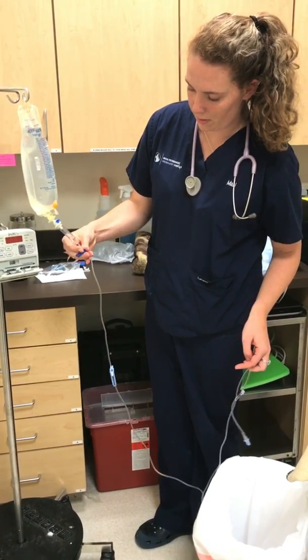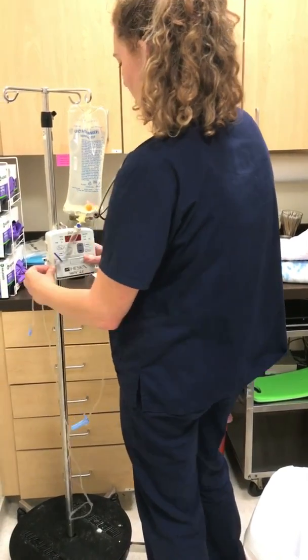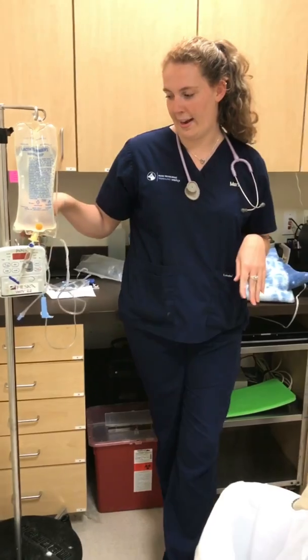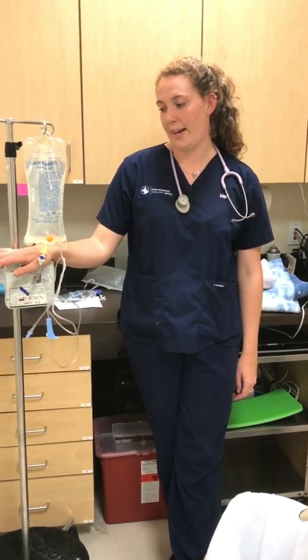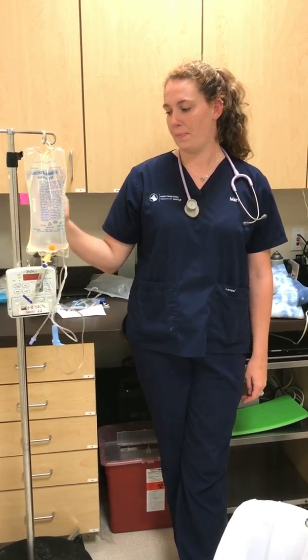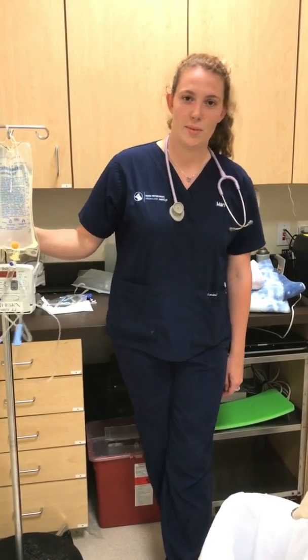Clamp that off and feed it through our fluid pump. Our fluid pump has been preset to 300 mils per hour. And then after the first hour, we're going to decrease that to 150 mils per hour. That's calculated at a rate of 10 mils per kg per hour for the first hour, and then we're going to decrease that by half to 5 mils per kg per hour. It looks like we've got everything set up appropriate for Kinsey, and we'll go ahead and give her pre-medications and start with our procedure.